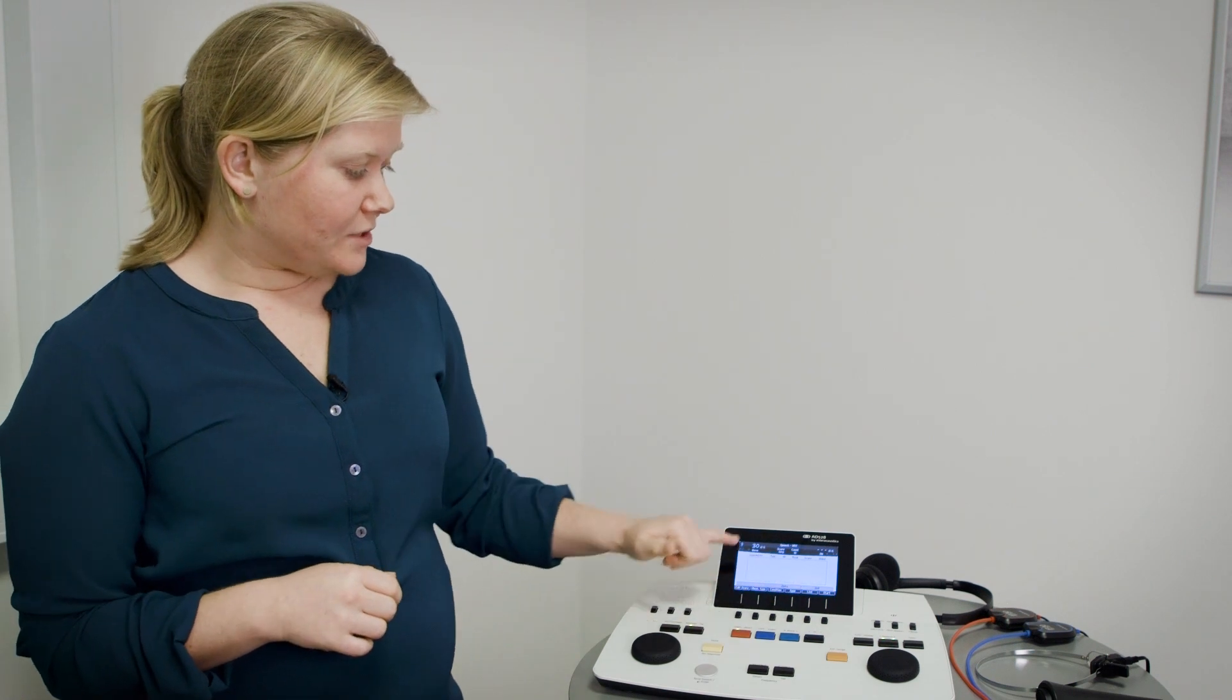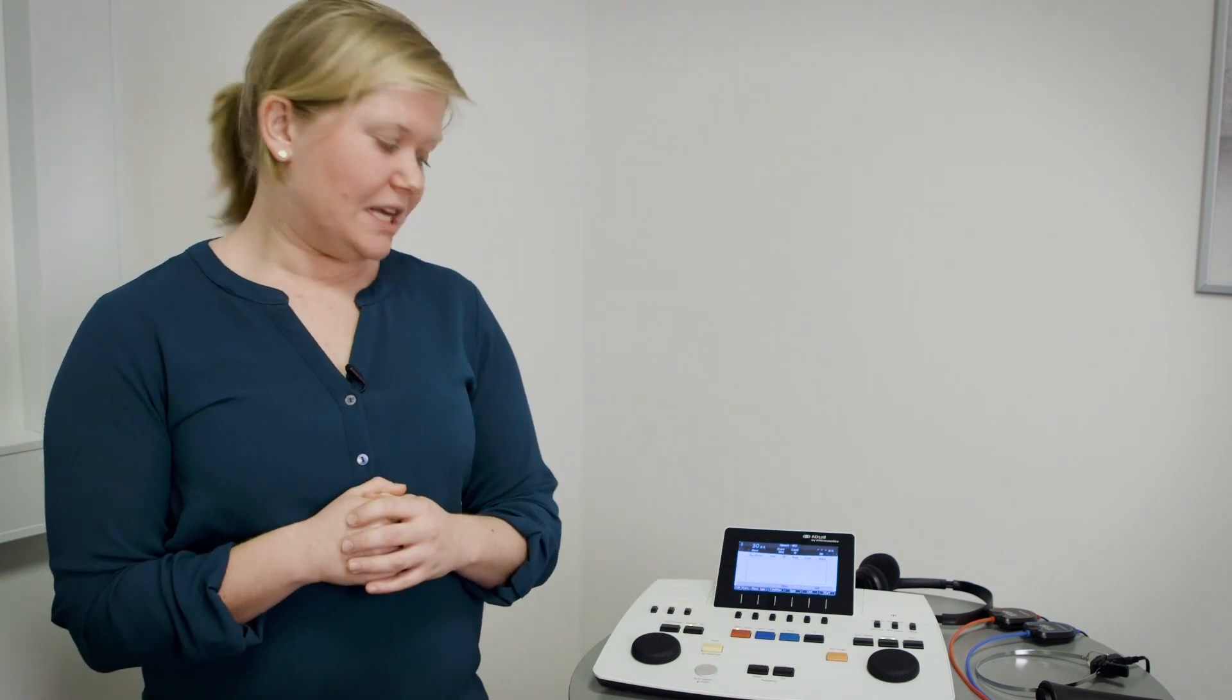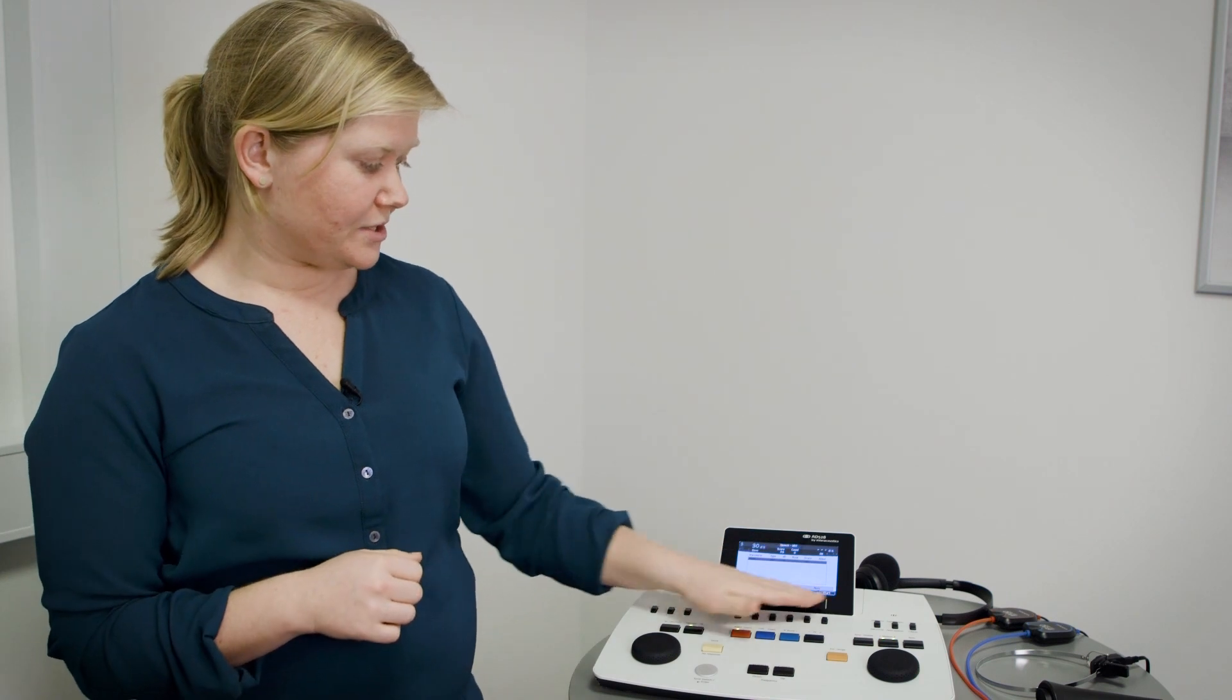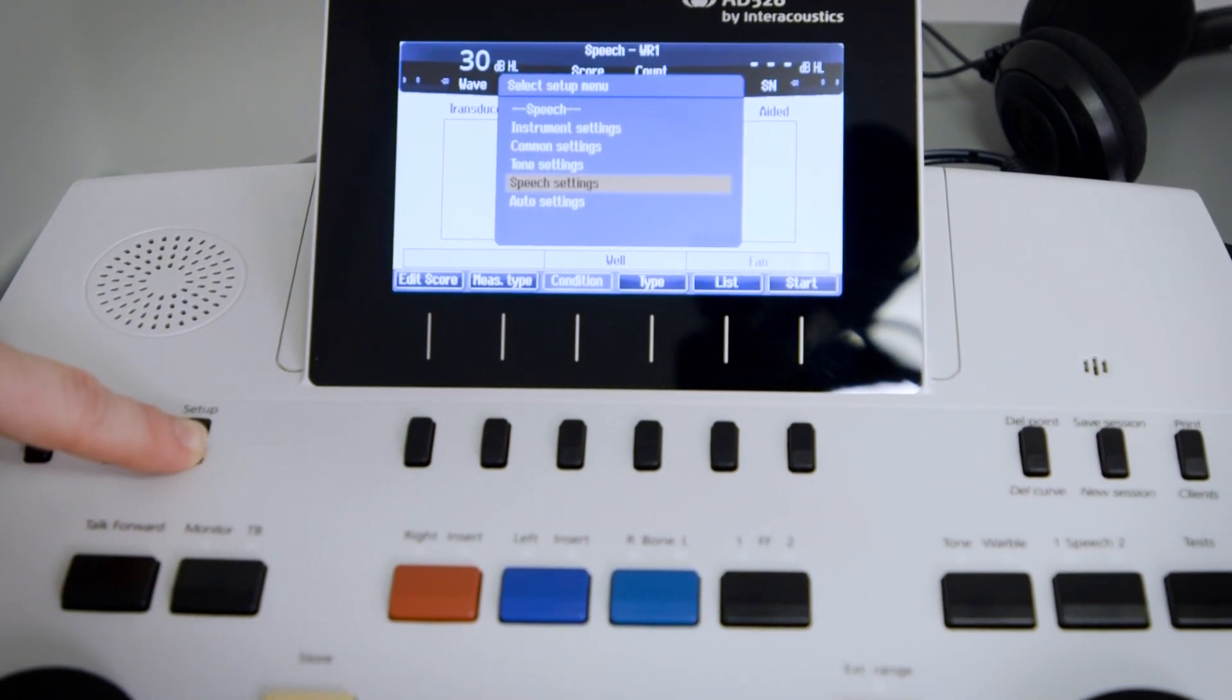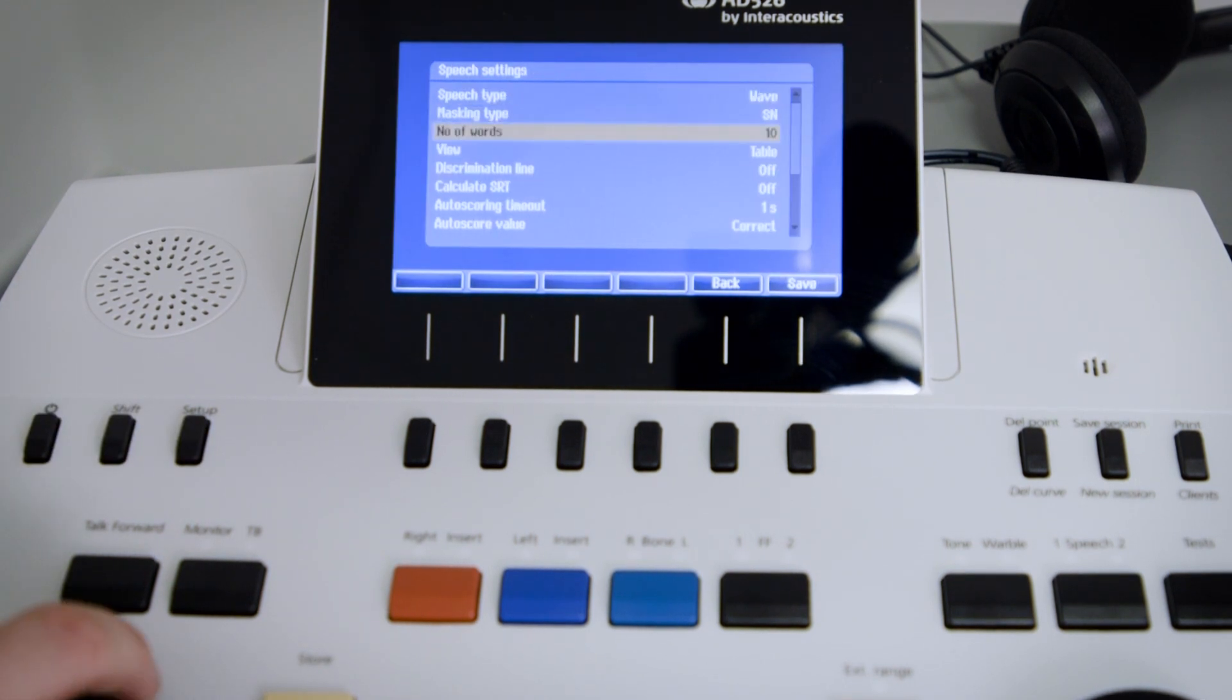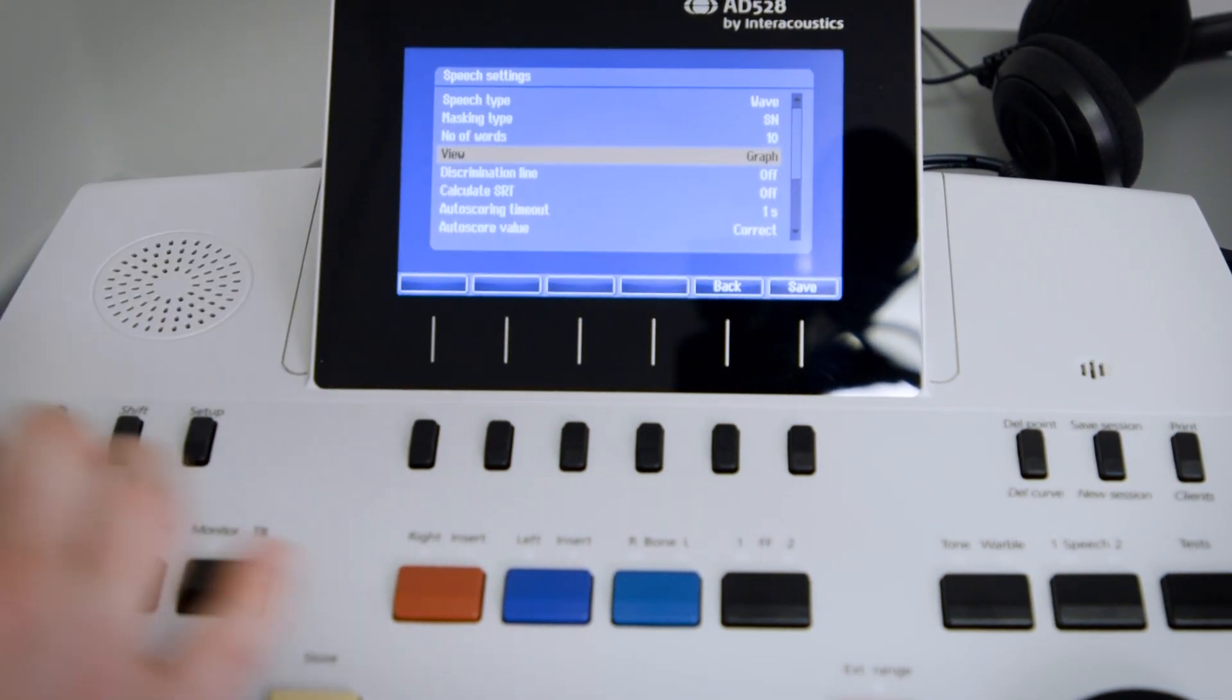Right now we have the table mode activated so we see everything in a table. So when I press store it appears in the table here. Instead of that we can also go into our speech setting and say I would prefer to see that in graph mode.